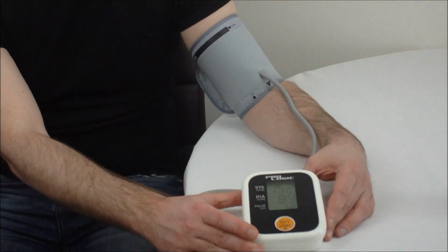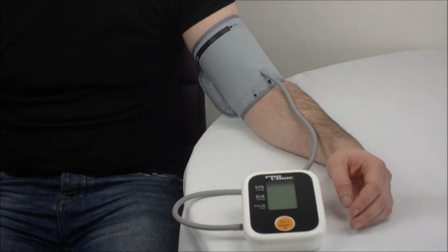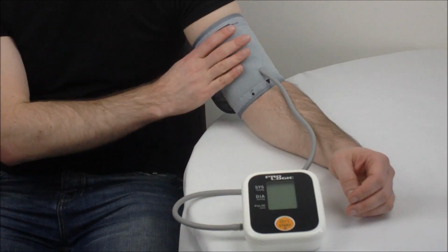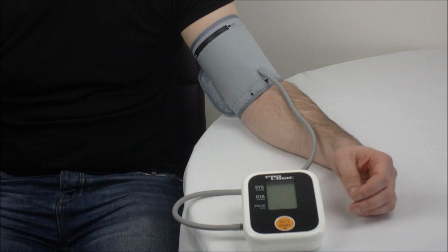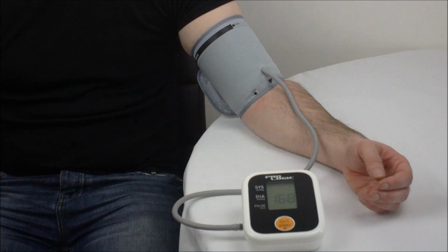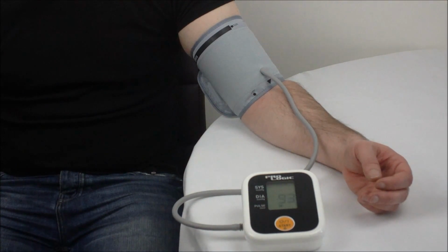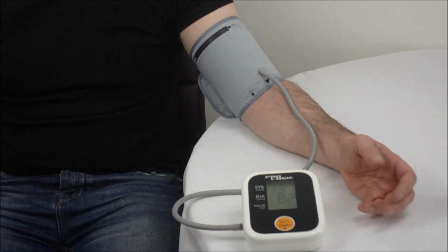So now I've waited 2 minutes and I've kept perfectly still, and I'm going to do the measurement again. So I'm going to press the button, there'll be a short delay, and then you'll hear the blood pressure machine start to compress air into the cuff. It's important that when you take your blood pressure, measure it from the same arm each time. So write on your results card an L or an R depending on which arm you're using, or make a decision to always use your writing hand or the opposite to your writing hand, but something memorable that you'll remember that you're measuring your blood pressure level in that arm.